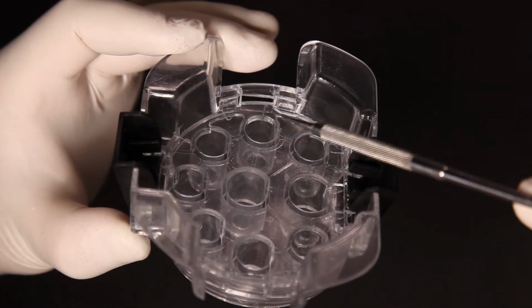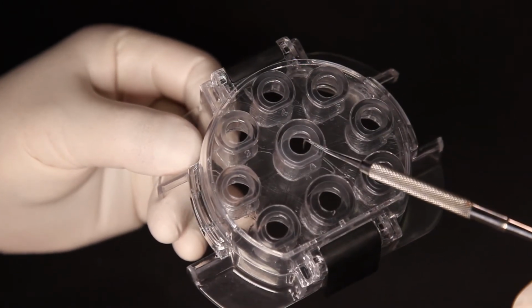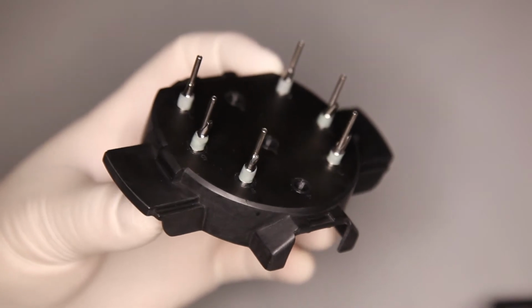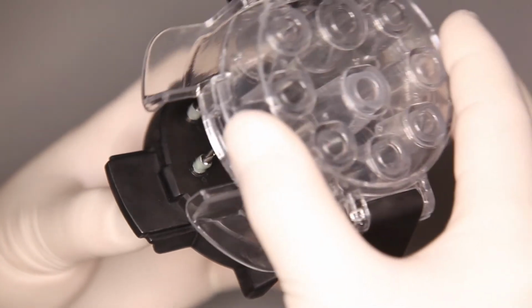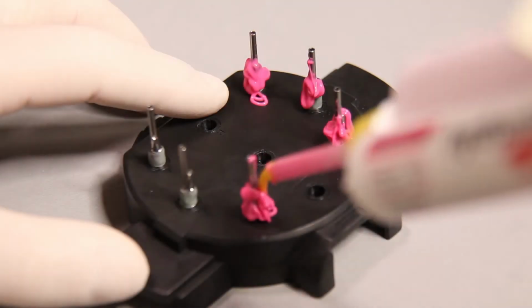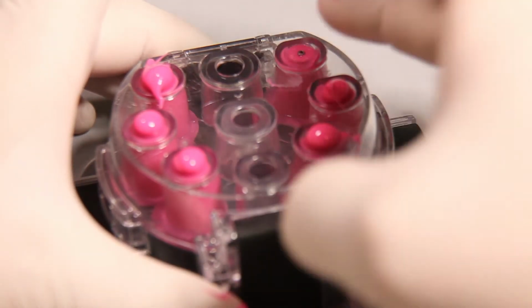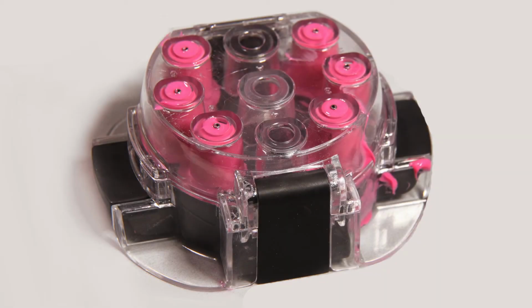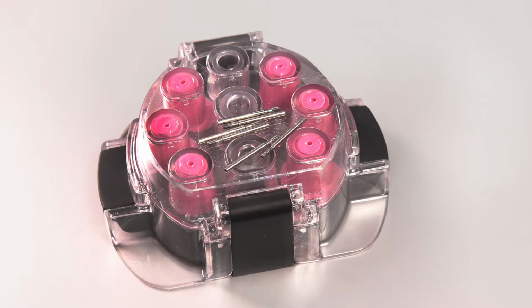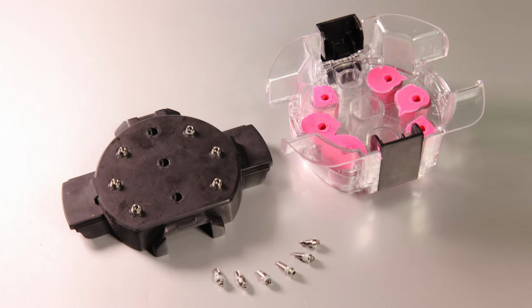The upper part of the box contains special terminals for each duplicated abutment. Terminals have through holes through which the elongated bodies of the screws protrude when the upper part is placed on the lower part. A small quantity of material is applied to the abutments in order to avoid air pockets. Then the material is injected into the terminals and the upper part of the box is placed. After solidification of the silicon material, hooks and screws are unscrewed, and the upper part of the box is removed along with the formed silicon casing.